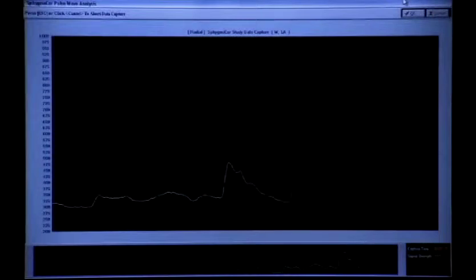When the tonometer sensor touches the skin, you will see a pressure signal on your computer screen. If you are applying too much downward pressure on the tonometer, the signal will climb to the top of the screen.